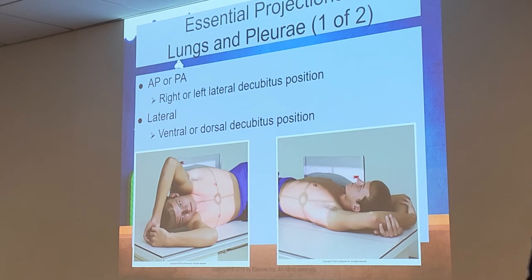Y'all see that? We do left lateral too. You can do left lateral too. It just depends on what you're visualizing. Which lung are we wanting to look at? And what are we looking for? Are we looking for air or are we looking for fluid?